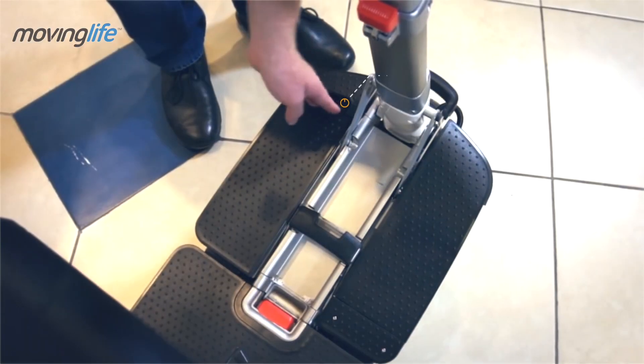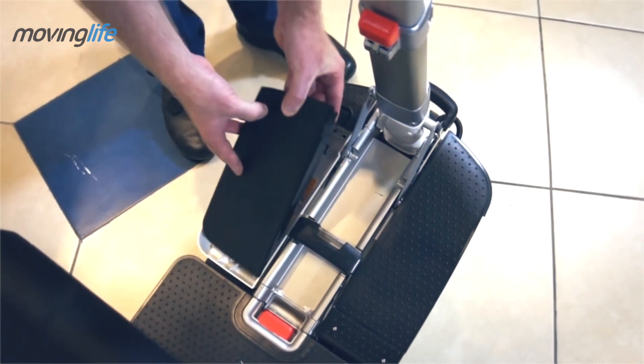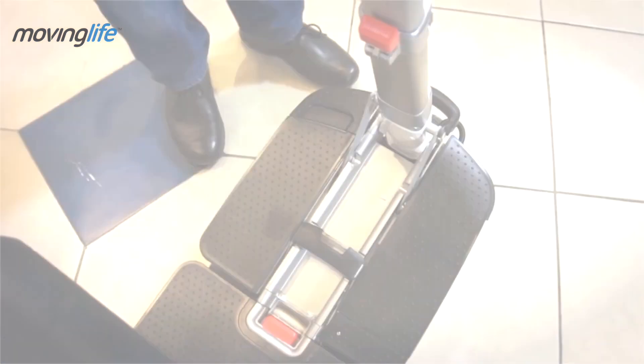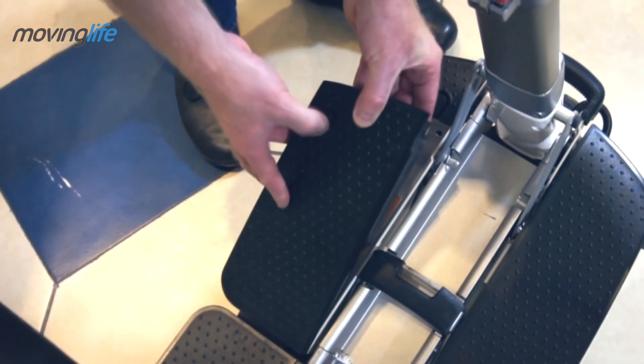To remove the battery, press the release button and pull the battery out. To reinstall the battery, simply put the battery back in place, back end first, and it will lock automatically in place.